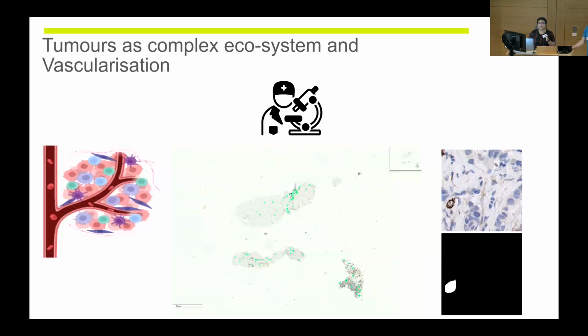Because the Inception network automatically has batch normalization, so I think it is already inside the network, but we didn't do stain normalization or anything, because stain normalization is totally different on an H&E and on an IHC image. So we have not used any stain normalization here, except the augmentation that we do regularly with deep learning, and the batch normalization that is within the deep learning architecture.